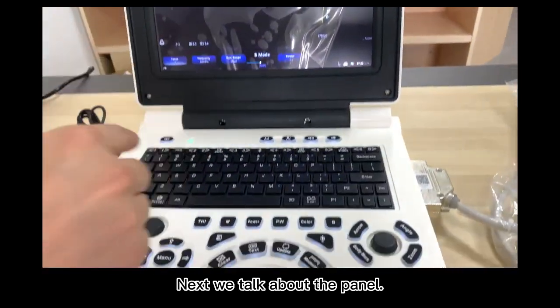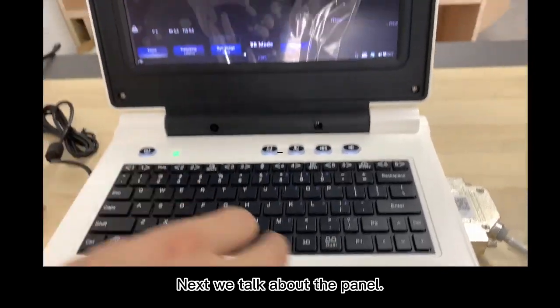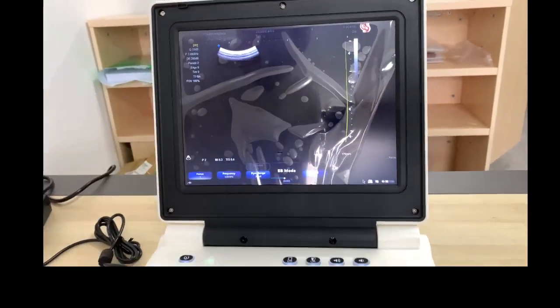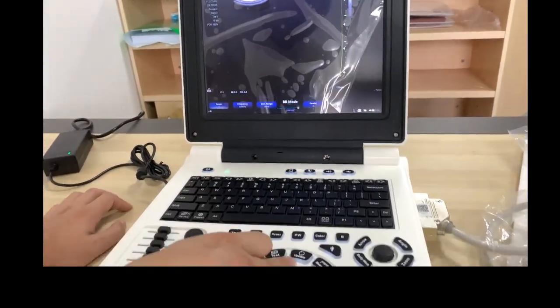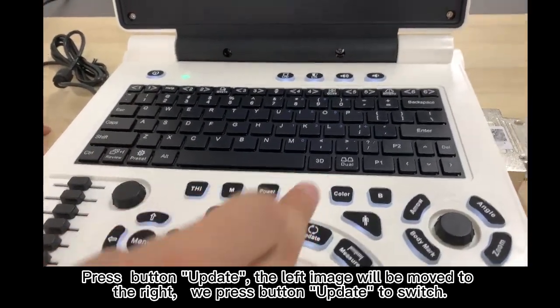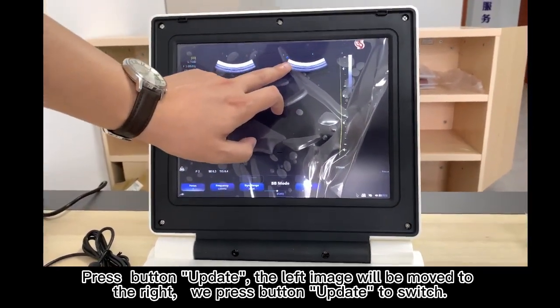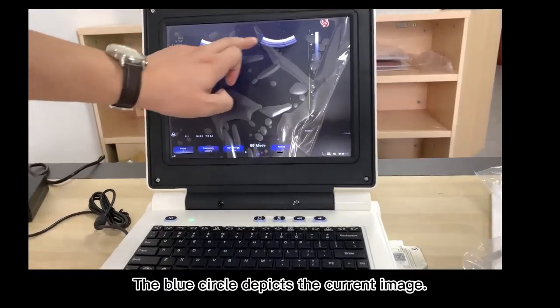Next, we talk about the panel. Press button dual. There are 2 images shown on the screen. The first image will be shown on the left screen. Press button update. The left image will be moved to the right. We press button update to switch. The blue circle depicts the current image.